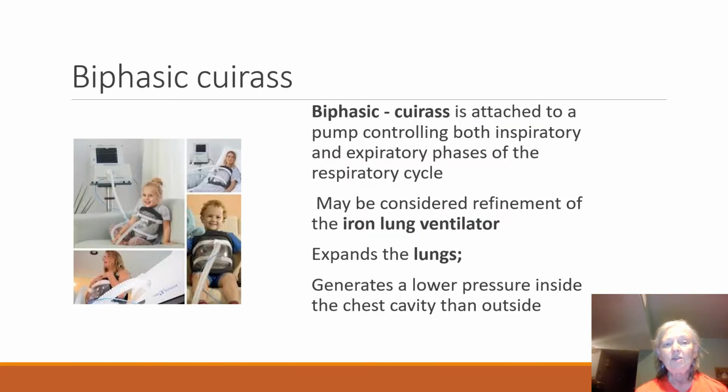And there's a new one out, the biphasic cuirass. This is just showing this to you in case anybody ever should talk about it. I'm sure there's disadvantages with it. I'm not quite sure what they are at this point. But it does control your inspiration and your expiration at that particular point.